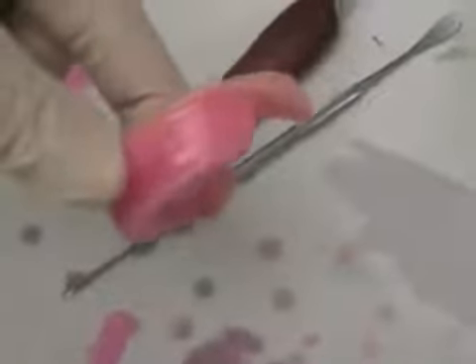The mandibular rim should be adjusted using the same techniques, but remember, it should be at the level of the corners of the mouth and intersect halfway up the retromolar pad. When using the wax former to melt and adjust the rims, remember to hold the rim in such a way that any melted wax drips away from the record base so you don't get it on the tissue surface and cause it to be unseated when you place it intraorally.